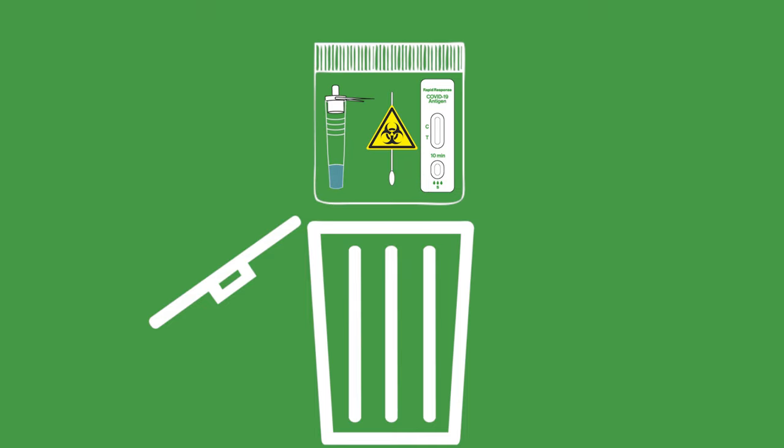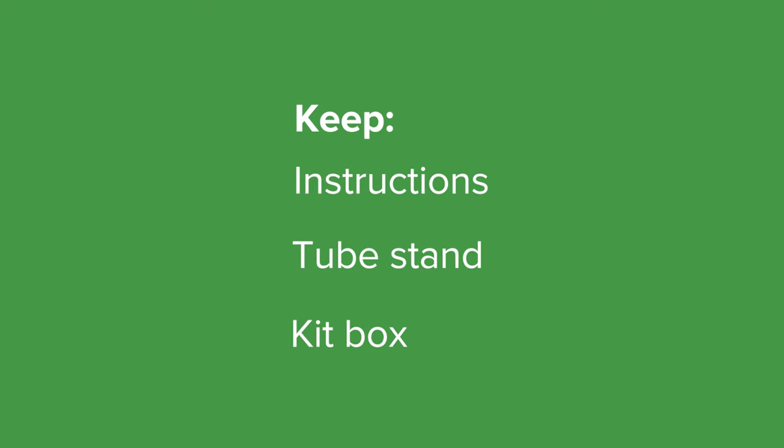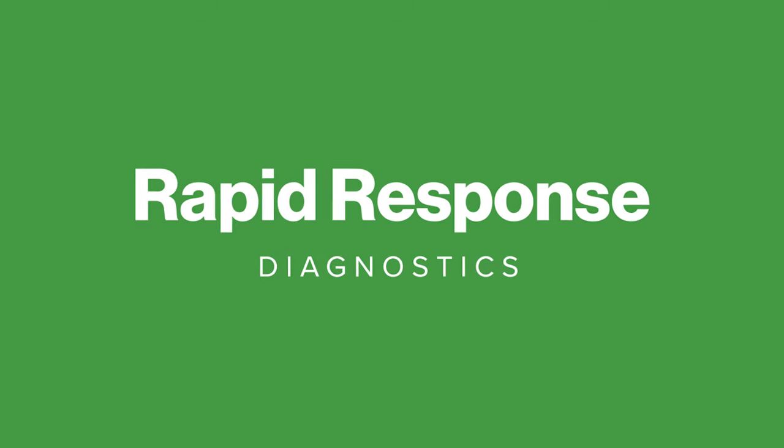Once you have read your results, put the test cassette in the waste bag provided and dispose of it in your household garbage bin. Keep your instructions, tube stand, and kit box until you have used all the tests in your kit box, as these can be reused for future tests. Choose Rapid Response — it's simple.